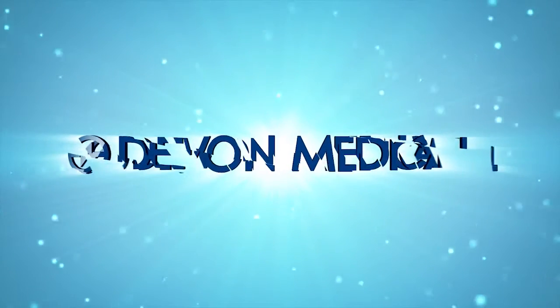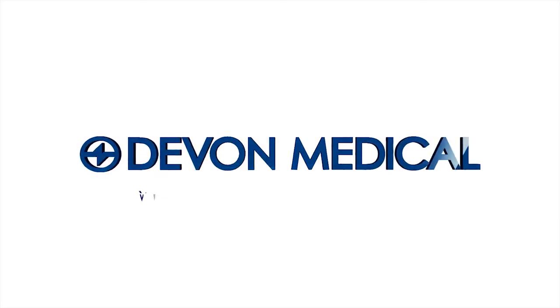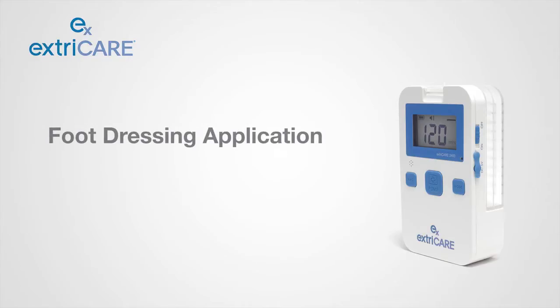Devon Medical, creator of the extriCARE Negative Pressure Wound Therapy System, has developed a new NPWT dressing to help treat non-healing wounds on the toes and forefoot. This instructional video will outline how to apply the dressing properly.